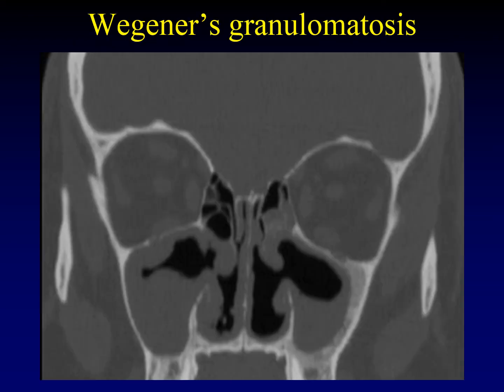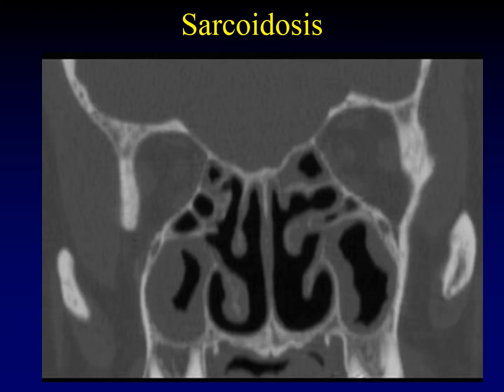Here's an example of Wegener's granulomatosis. You can see loss of the intranasal contents, particularly truncation of the inferior turbinate and erosions through the walls of the sinuses. Sarcoid can look just like Wegener's granulomatosis — in this case it's predominantly affecting the ethmoid air cells, but you can also see truncation of the inferior turbinate.